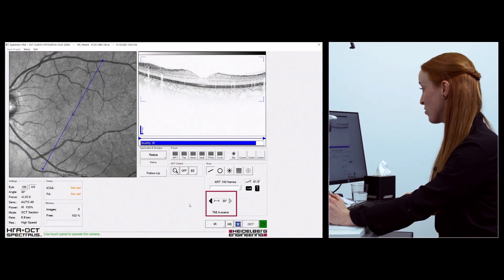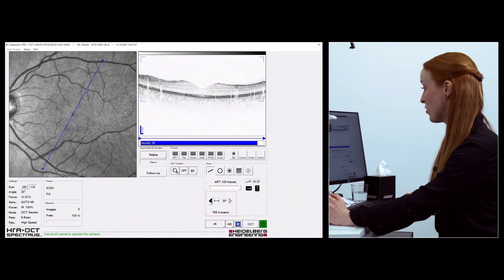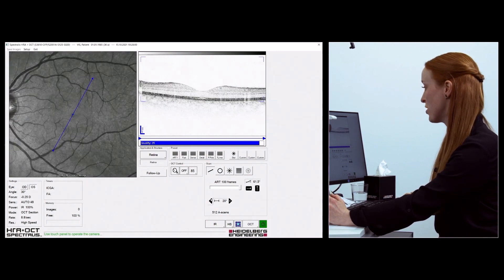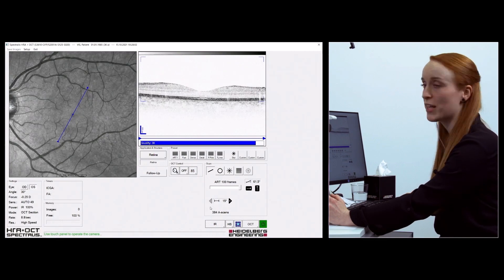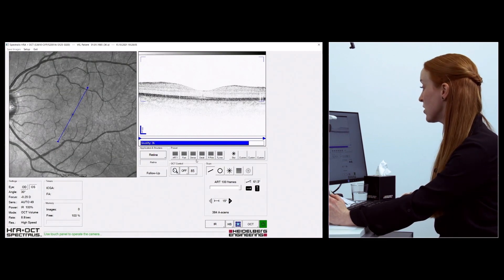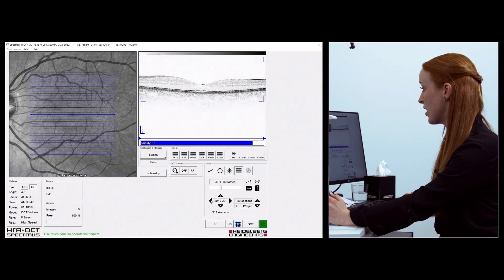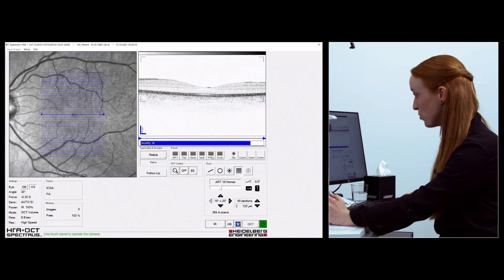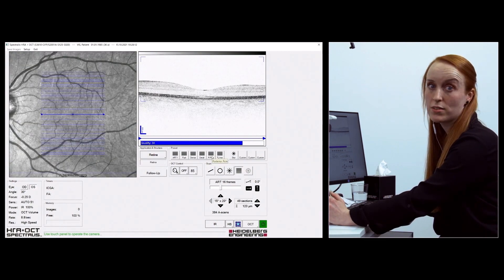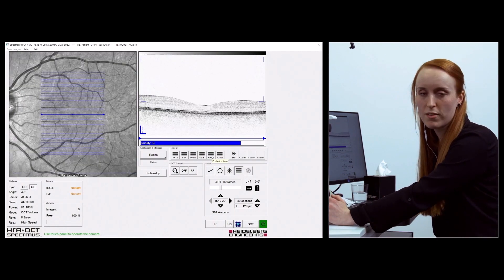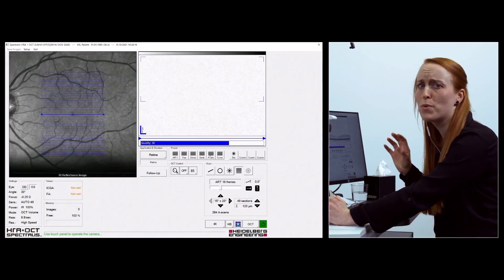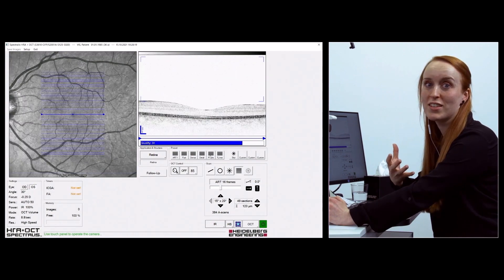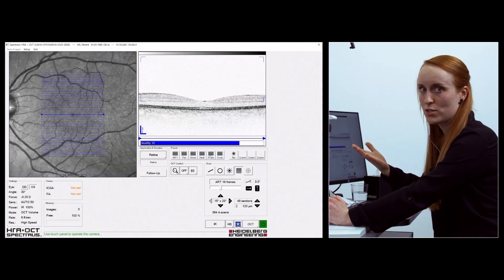How to change the length of the scan? This is right in your graph corner - there you have the length of the scan and you can just shorten it by pushing the minus sign. This can be done for each and every scan you can find here. You can choose a preset scan and change it to your needs, and it's important to do that right from the beginning so it's chosen as you like it in all follow-up sessions.